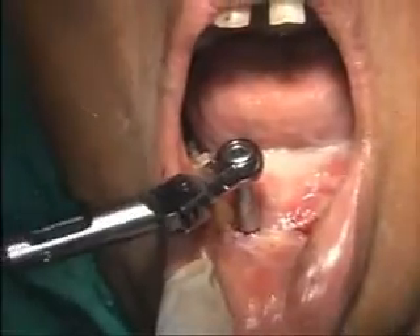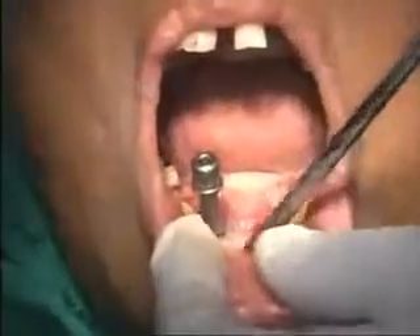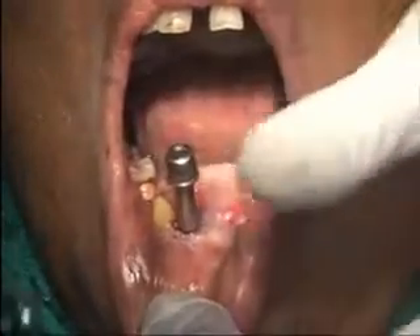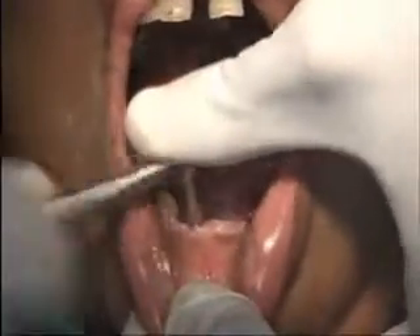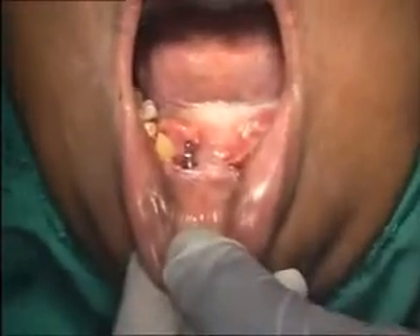Implant insertion procedure is over. Sometimes I don't like to grind and I am not in an area where there is no anatomical landmark here. I will just try to see if I can turn it maybe 2-3 turns more. Now I don't have to cut the top, because this implant has a vertical polished shaft all the way — so it is not a big issue. I think now we are exactly at the level of my cutting; I will not have to.